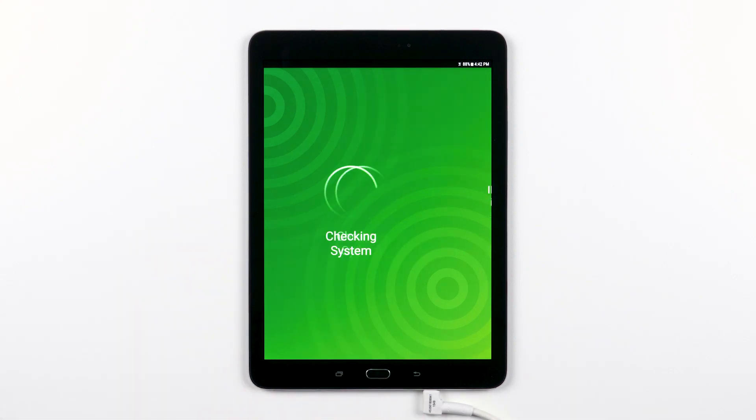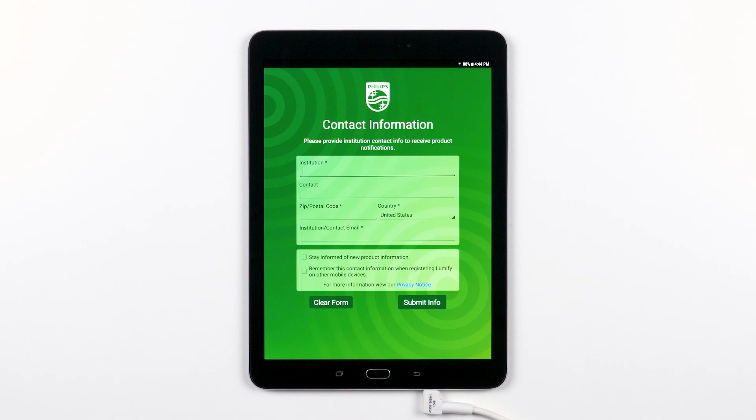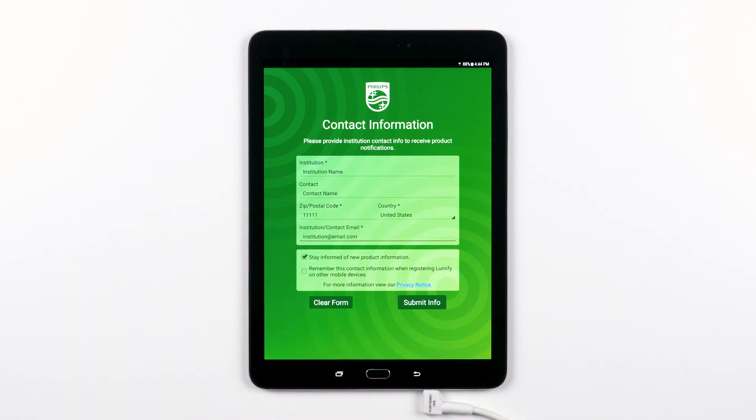Demo mode can be used when you don't have a transducer connected and want to access the app features in a non-scanning capacity. The next dialog that pops up will explain why we are going to ask you for your information as you register your transducer. Click Continue and then fill in the required information in case we need to get in touch for important product information. If you want to keep informed about any products or promotions from Philips, check that box. If you want to save a few keystrokes and avoid typing in this info next time you register your transducer to a tablet, go ahead and check that box. When you're ready, hit Submit Information.